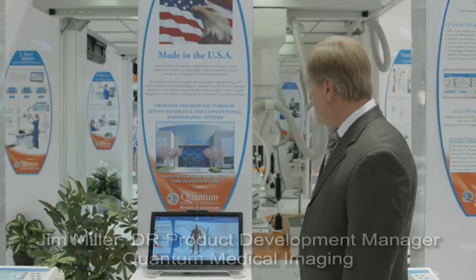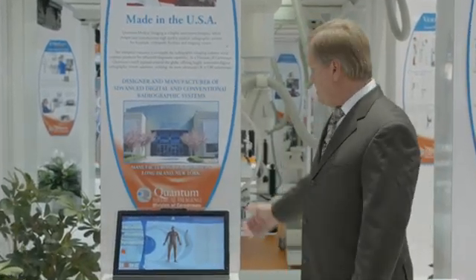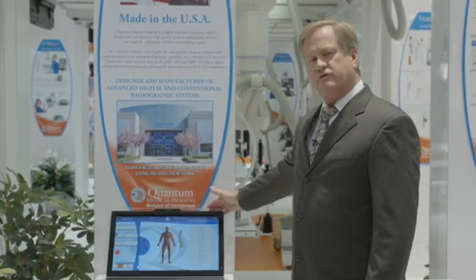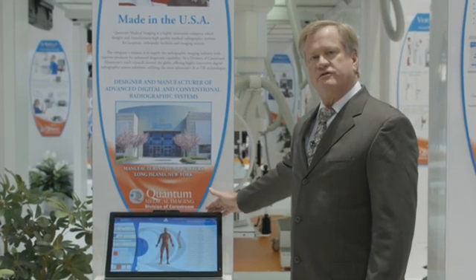I'm Jim Miller with Quantum Medical Imaging, a division of CareStream, and we're here at RSNA to show you our line of generator x-ray consoles. All of our generators are manufactured in our operations in Long Island, New York, beginning here with the QVision with a high definition color touch panel monitor in generator outputs from 32 kW to 80 kW up to 150 kVp.